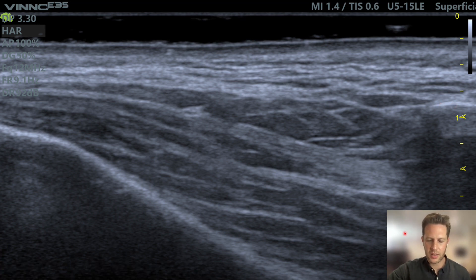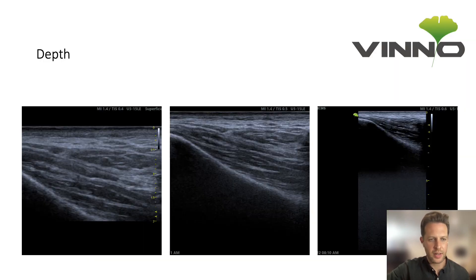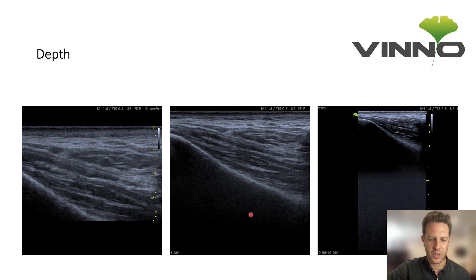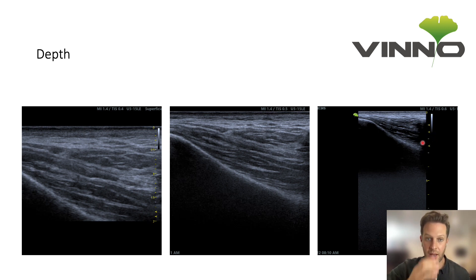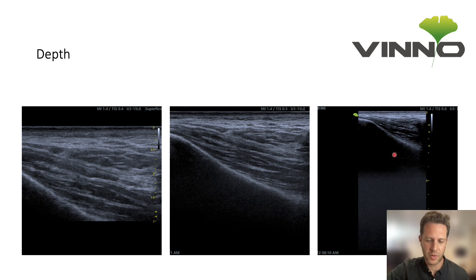Let's look at options for optimizing this type of image. The first button I always suggest optimizing is depth. In the middle we can see a fairly well-optimized picture for depth. On the left, we've zoomed in too much and are missing the bottom of the temporalis muscle. On the right, we're zoomed out too far, making it difficult to see detail. Depth is like framing the picture and is the very first place to start.